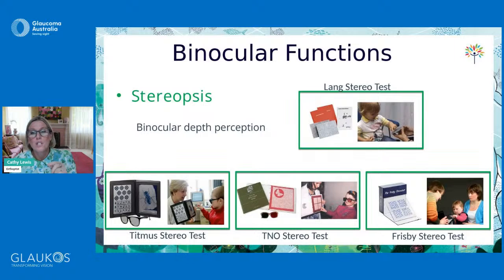They simply point to or say the name of the image that they can see on the card as they sort of come out in 3D towards them. So all of these tests have been a summary of the baseline tests that we would do on most children coming to an eye clinic, and they can be done on children of all ages. And we would do these on children with glaucoma.